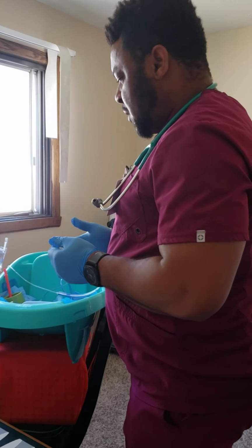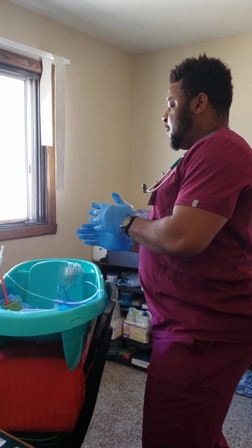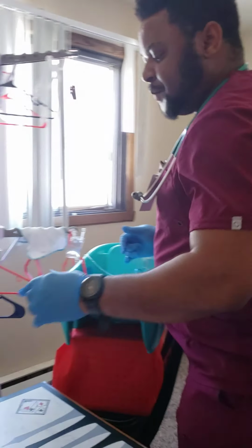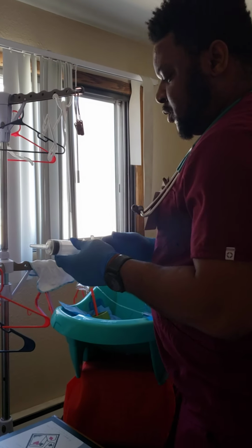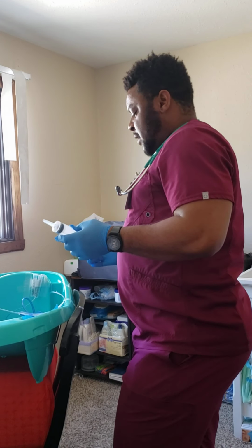I will then want to, because when the patient is placed on suction, the tube in the stomach can be displaced to the side. So I want to use my piston. I'll use my piston. I'll put in air, about 5 milliliters of air, in order to push the tube into the stomach from the side.